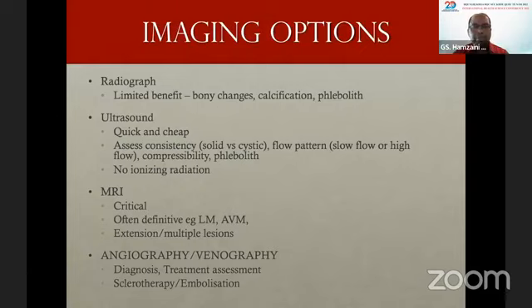Before we start any treatment, for example, venous malformation, we would inject a contrast to see whether there is any large draining vein draining the venous malformation. And angiography is also used to do sclerotherapy. It's also used to do embolization in the case of arteriovenous malformation.